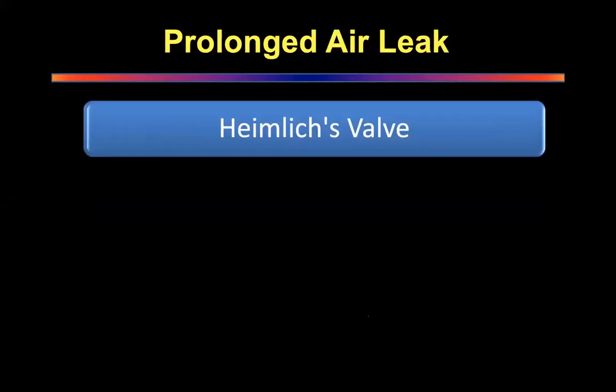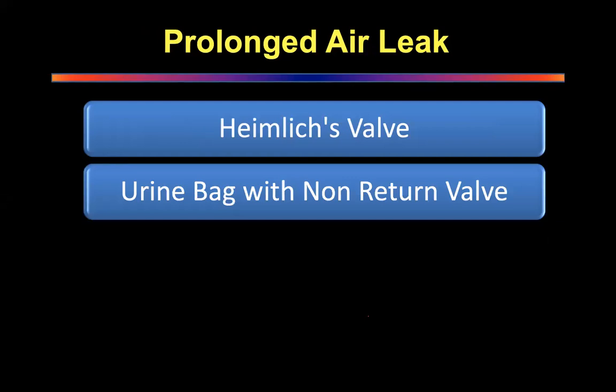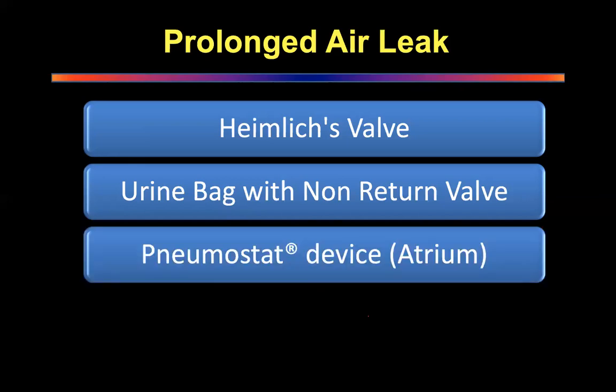All right. Heimlich valve is a much touted technique for post-operative prolonged air leak, and I'll tell you about it. In India, in the UK, I use Heimlich valve, easily available, not expensive. In India, I use a urine bag with a non-return valve. I'll show you that in a minute. I just cut off the tip and connect it to the bag, and it's a beautiful tool, works very well, gets the patient mobile very fast, okay?